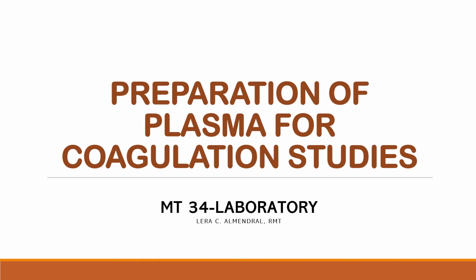Hi everyone. So today we are going to talk about preparation of plasma for coagulation studies. Before we can proceed with the coagulation testing, the first step that we need to perform is specimen collection.